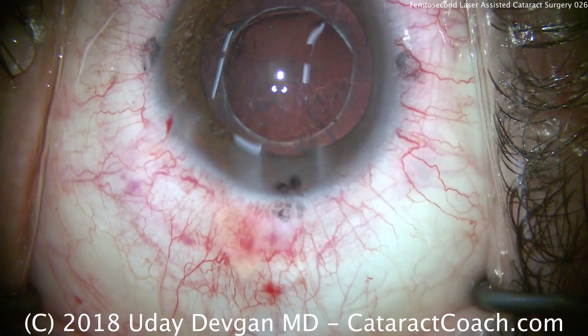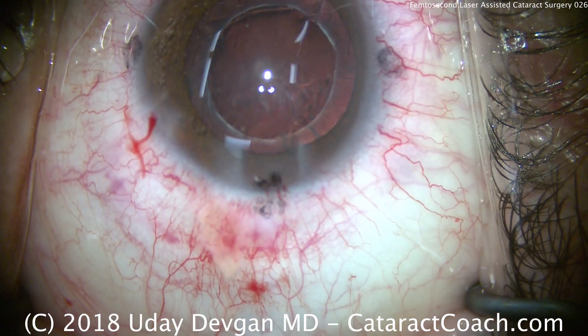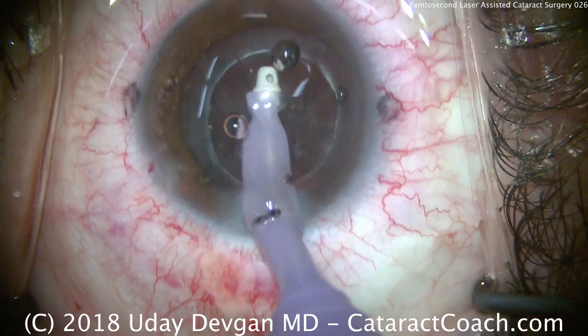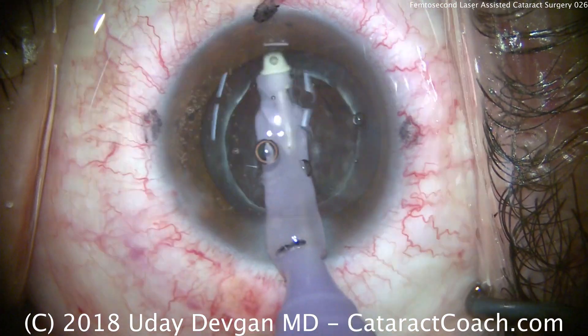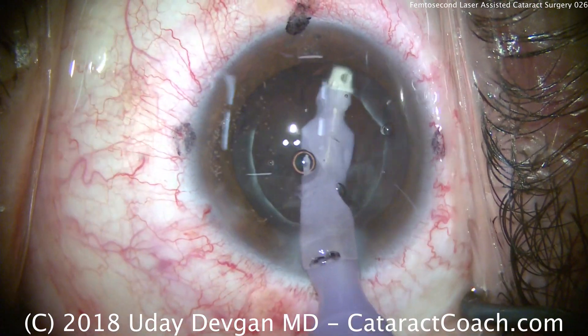There's a little subconjunctival hemorrhage visible temporally, just under the main incision in the surgeon's view — that's from the suction ring used for the femtosecond laser. Now the irrigation-aspiration probe is used to remove the cortex as well as any residual epinucleus.